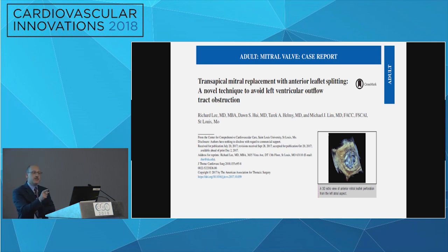Correct. What we've learned is that with LAMPOON, people actually lacerate the leaflet and they get torrential MR. Because of this, our surgeons were very reluctant to do this without any protection. So all 3 cases were done on cardiopulmonary bypass. And as you can see, we didn't need to pace the patients when deploying the valve in the mitral position, because we had complete flow on the cardiopulmonary bypass and almost cardiac arrest, or no cardiac flow.